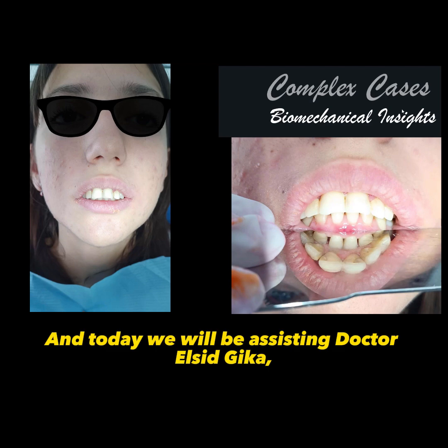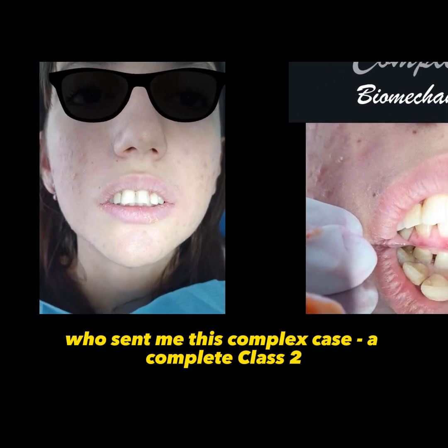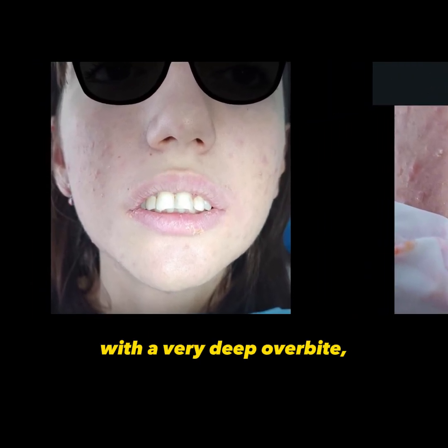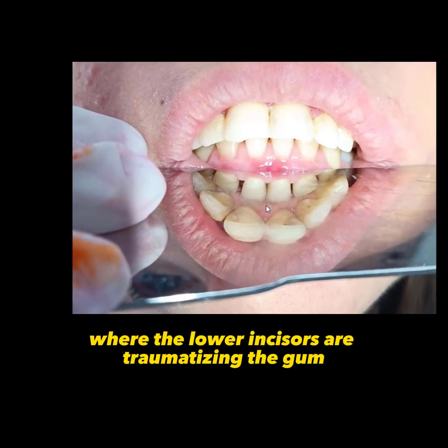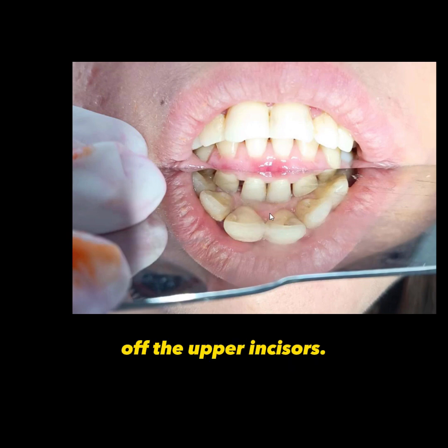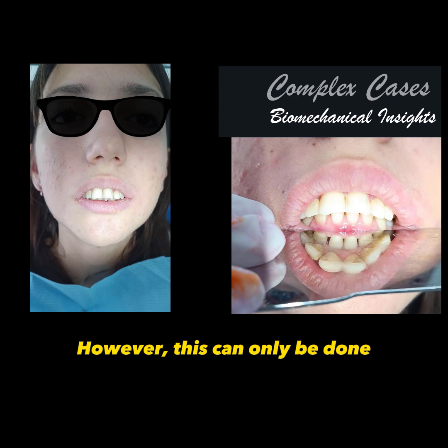Today we will be assisting Dr. Elcid Dica, who sent me this complex case: a complete Class 2 with a very deep overbite, where the lower incisors are traumatizing the gum of the upper incisors. The focus of this treatment will be on the movement of the upper anterior teeth. However, this can only be done after removing this mechanical trauma.